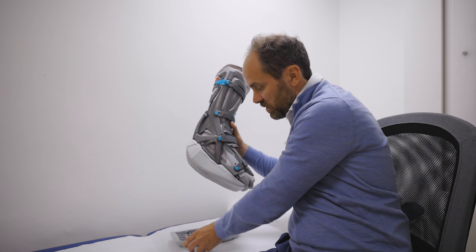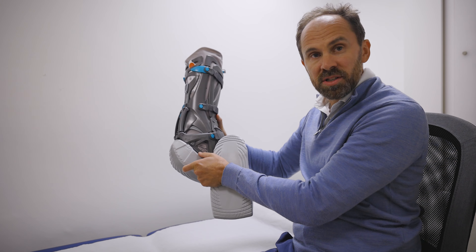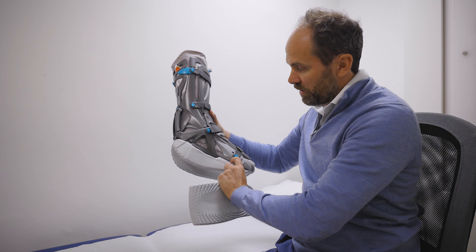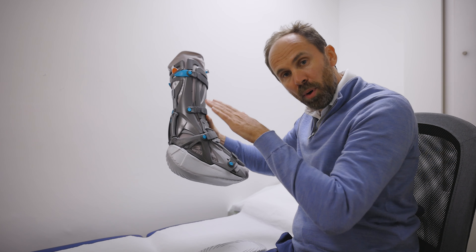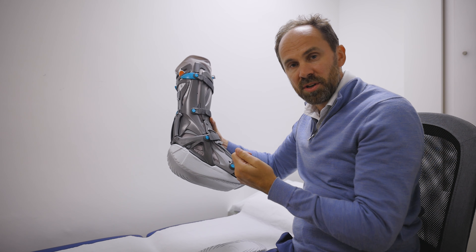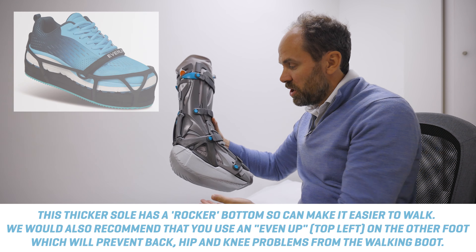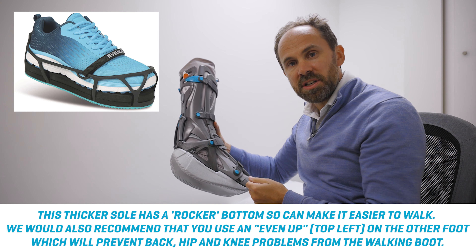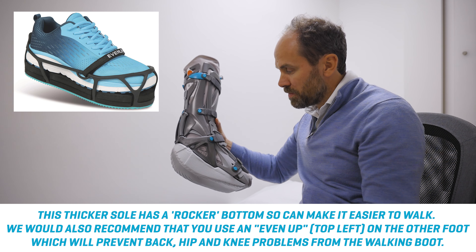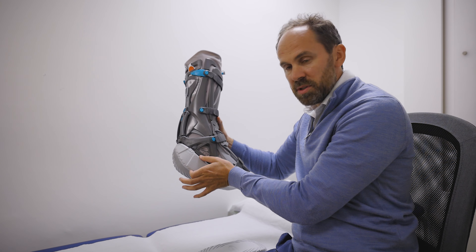The first thing is it's often going to come with two soles. You can see the bigger sole, which is much bigger at the back and thinner at the front — that's going to keep your foot in a toe-pointed position, what we call a plantar flexed position. Generally, at the beginning of the healing process, you need to be in full plantar flexion, which is around 30 degrees. You must make sure at the beginning of the treatment process that you're using the thicker heel.